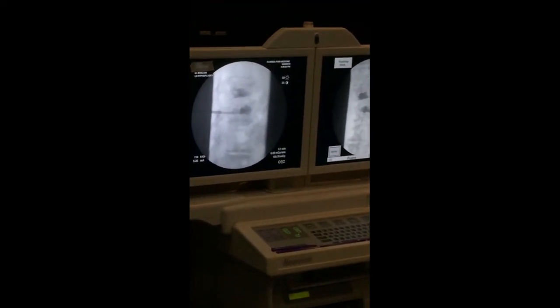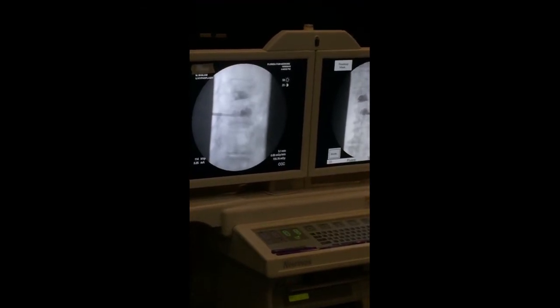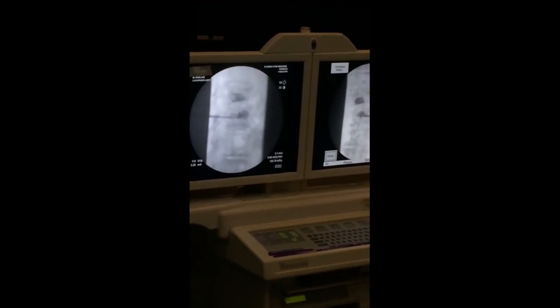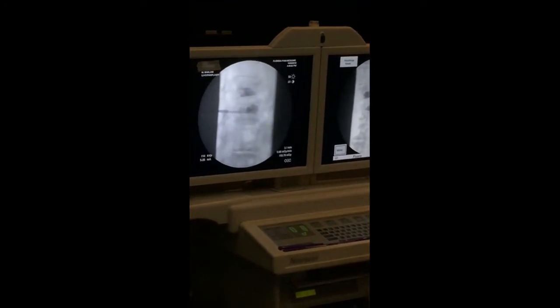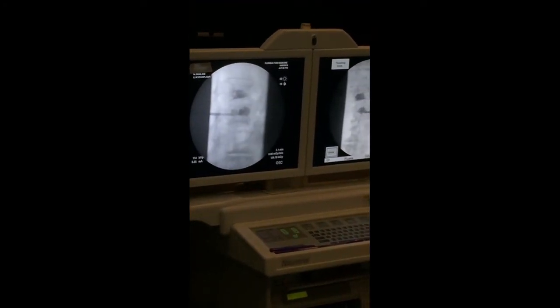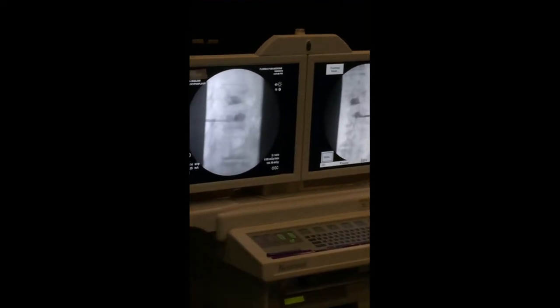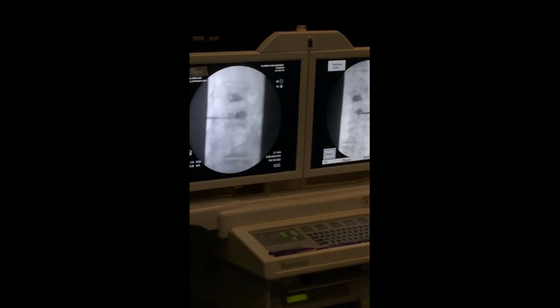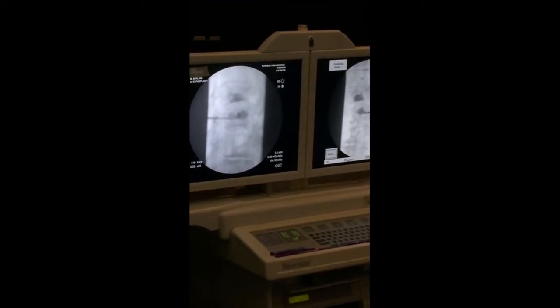All right, that looks pretty good, okay? Are you feeling all right? Yeah. A little what, sweetie? Just a little discomfort there for a second, too. Okay. I think we're done, man. So it looks pretty good. You see, you're getting spread both ways, correct? You cross the entirety of the body, essentially, okay?